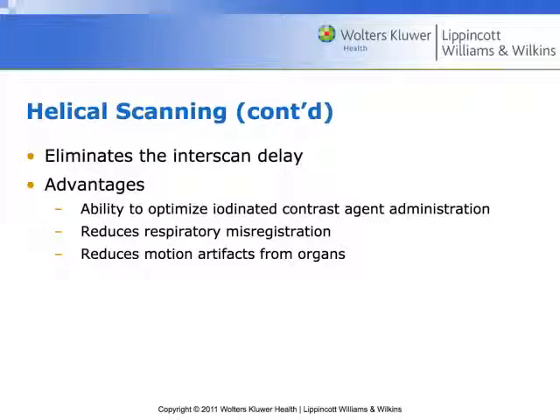What does that mean? It gives us, basically, like if you can imagine this being a volumetric set, I have everything that's in this bottle of water here. Anything I want to do with this bottle of water, I can. Versus something like this CD, I have just this CD, right? So if I'm talking about a slice, I just have this. If I'm talking about a volumetric data set, I have the entire volume, every which direction of it, and I can do any kind of modeling from that.